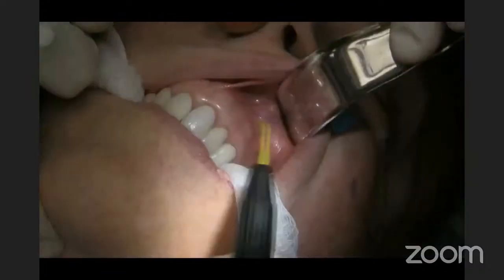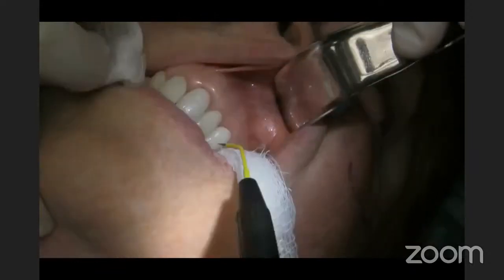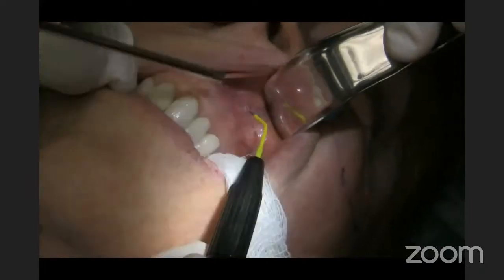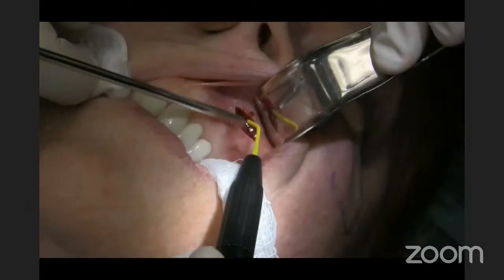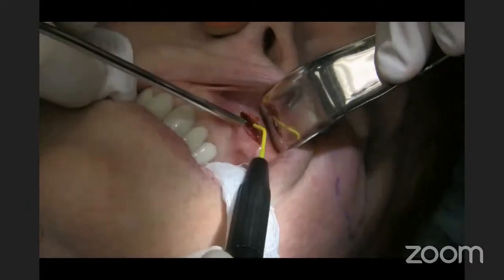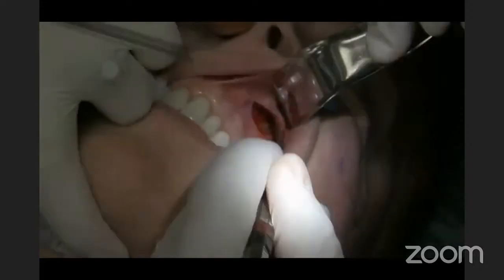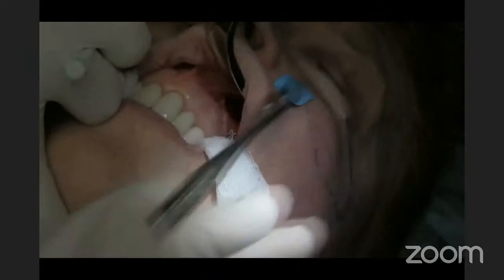At this point, then, we will make our incision. The incision is made just about a centimeter above the attached gingiva into the sulcus, above the canine tooth, the third tooth over, and I'm using the Elman radio wave microneedle here, which is generally a pretty bloodless incision, all the way down to periosteum, and that's extremely important. These implants need to be subperiosteal.